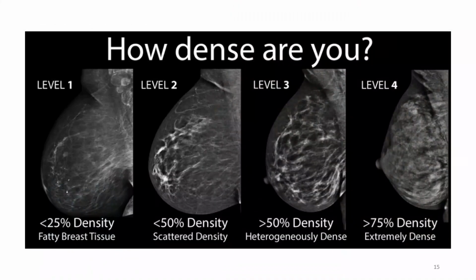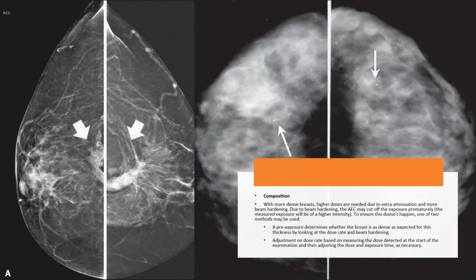Let's return to looking at the breast tissue and how to demonstrate this tissue with our mammographic systems. Based on the type of tissue that we're trying to analyze, we will modify our beam filtration or beam hardening to be able to demonstrate through the thick breast as opposed to the more contrasty fatty breast. When we increase the kVp, of course, we also increase the scatter radiation or shades of gray.